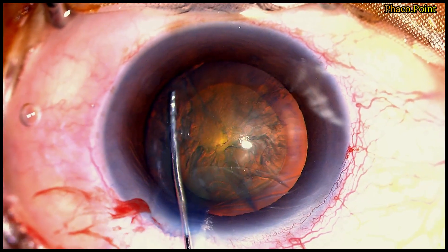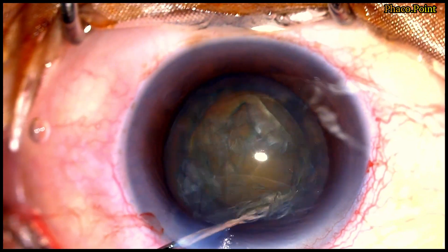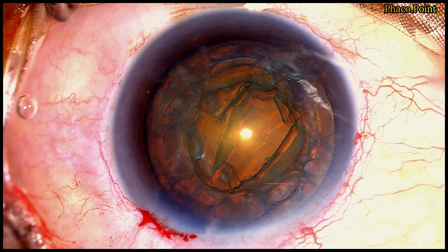We now move to the final case of this series. Let's watch this nucleus disassembly. Once more we start with the hydrodissection, followed by the hydrodelineation. Having demarcated the endonucleus, it's now time to pre-chop this very soft endonucleus.